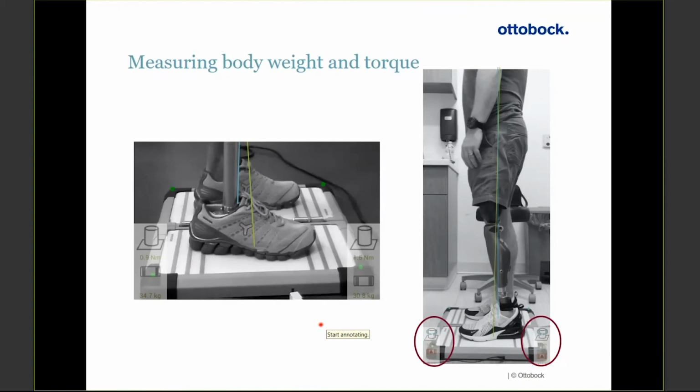And I had a colleague or a customer actually describe a really interesting situation where she used this specific thing with the L.A.S.A.R posture to have an approval or part of an approval for a microprocessor knee. So the patient was coming in saying that they felt unsafe and didn't want to load their prosthesis.